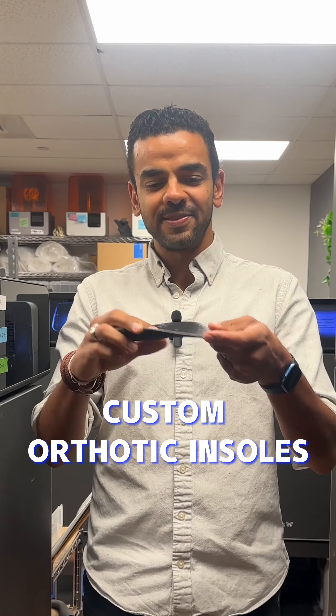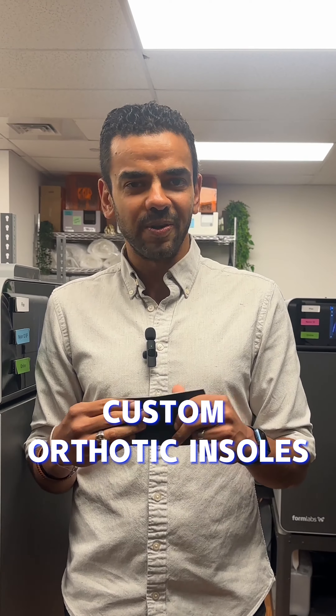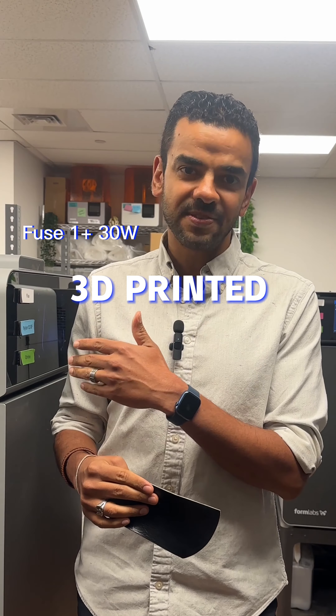I don't know about you, but I wear custom orthotic insoles. Unlike yours, mine were 3D printed — printed on the Fuse One Plus printers from Formlabs. A room like this can print thousands or tens of thousands per year.